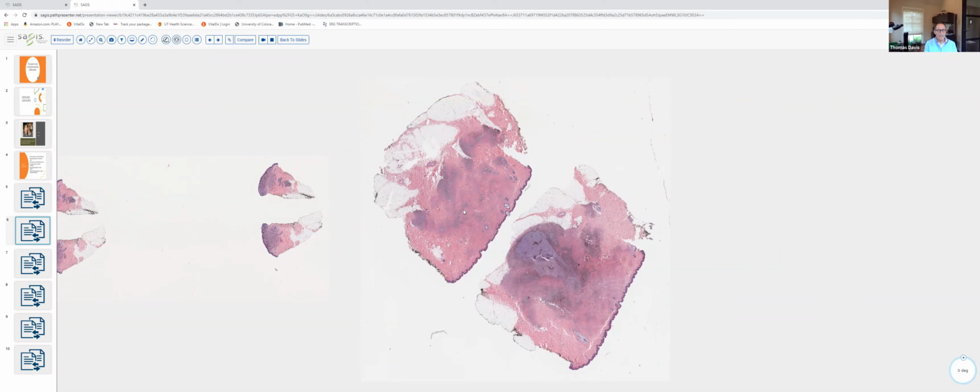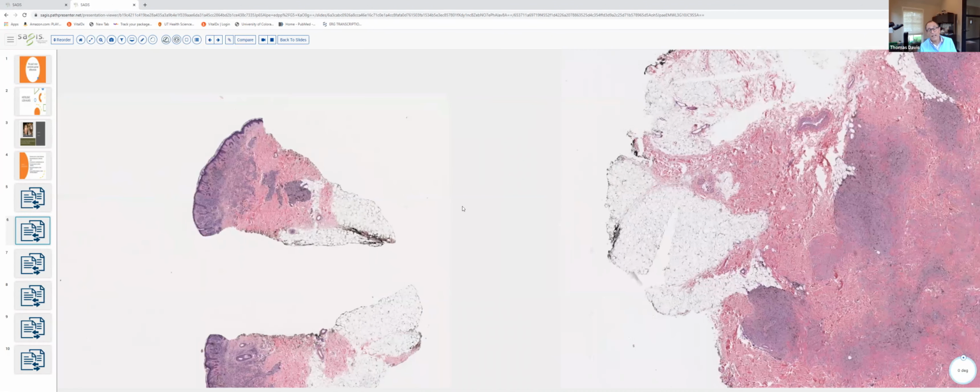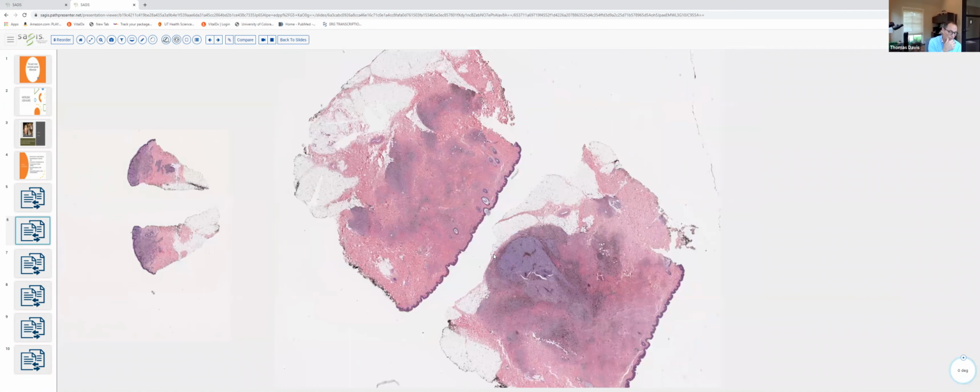Well, I think you can see even on scan, both are characterized by bulbous cellular and expansile aggregates of pigmented melanocytes, which can extend into the deep dermis and sometimes even, as we can see in the cellular blue nevus on the right, into the underlying subcutaneous tissue. And they both may show a tendency to grow along neurovascular bundles. So, at first blush, they appear quite similar.